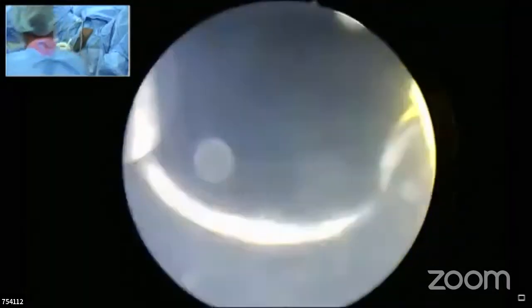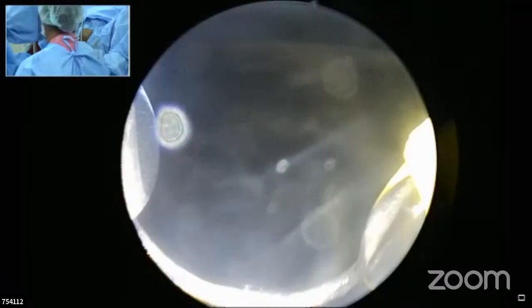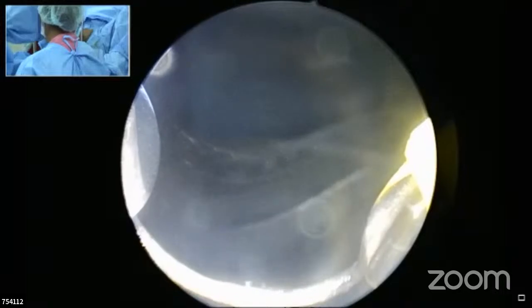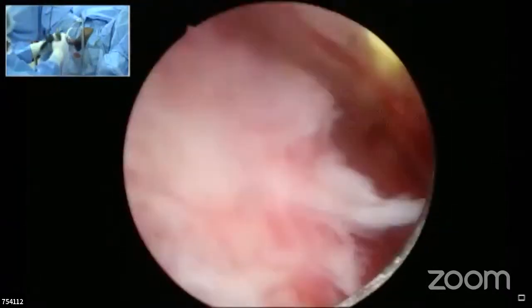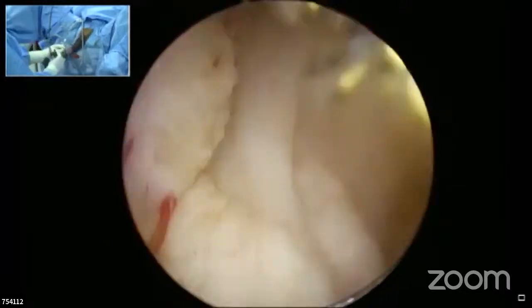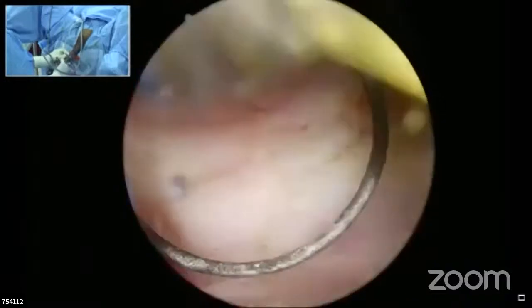And that is the reason why that doesn't drain. Even though Taif is using a continuous irrigation sheath, he has to empty the bladder now and then, because these vacuoles will form. They'll stay inside the bladder, and they'll be troubling. So now and then you need to empty the bladder to get this air out, which doesn't come out of the continuous sheath. It goes into the top of the bladder.